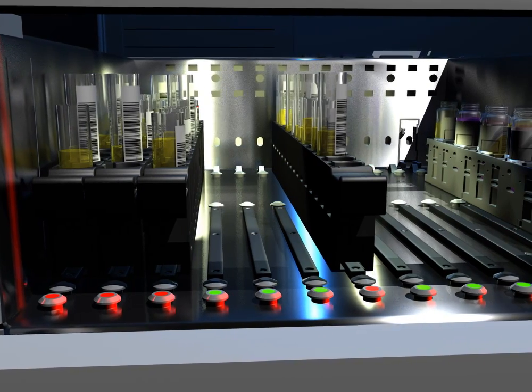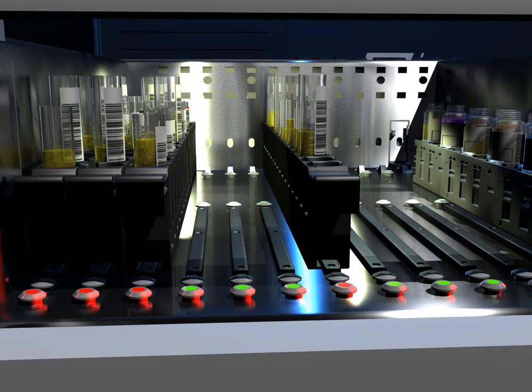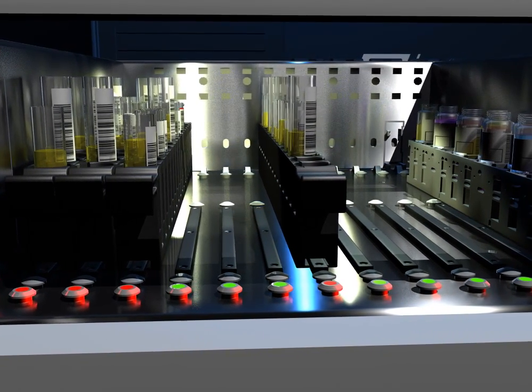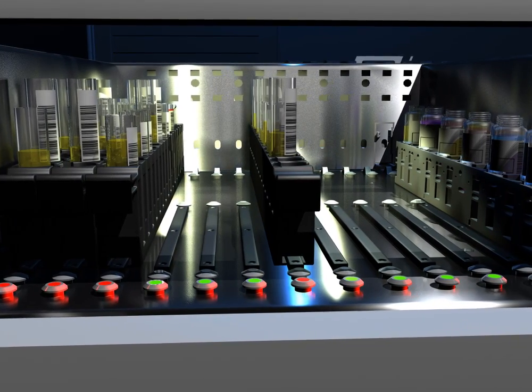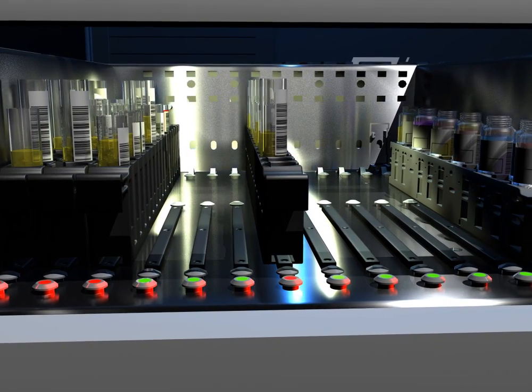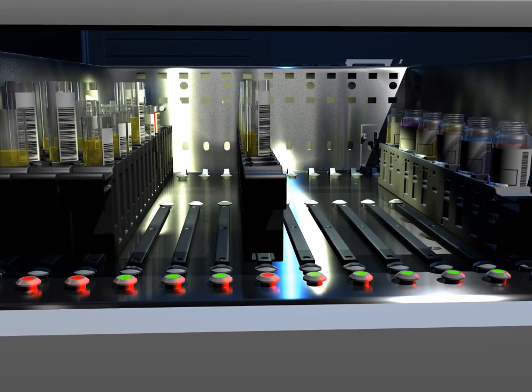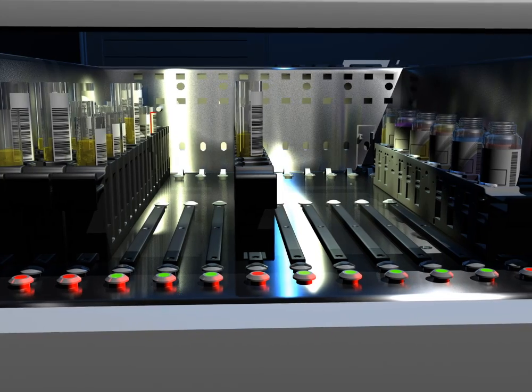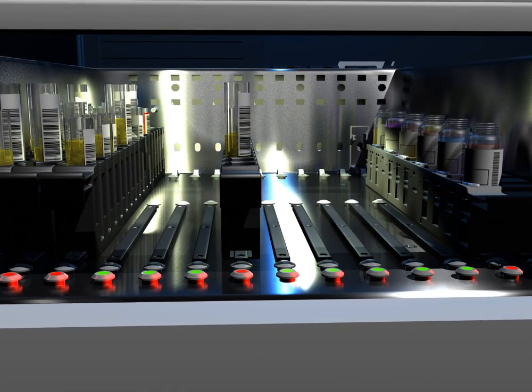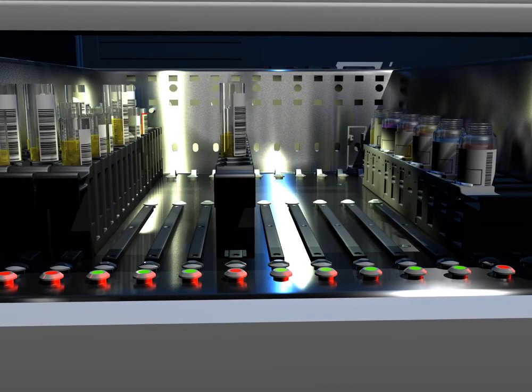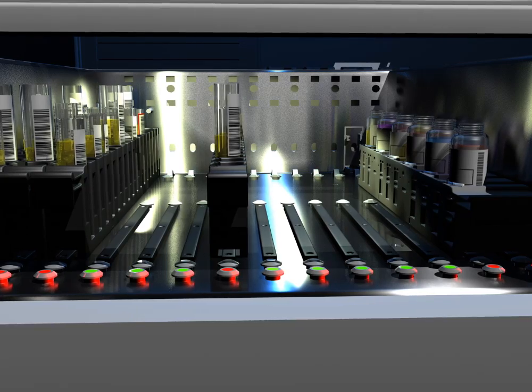A red light means that the pipetter is currently aspirating samples or reagents from that rack. Think of the LEDs as a traffic light to guide you. Green means go, red means stop, and orange means you make the call. This translates into a simplistic user interface.